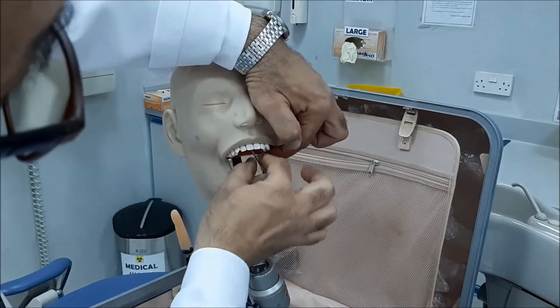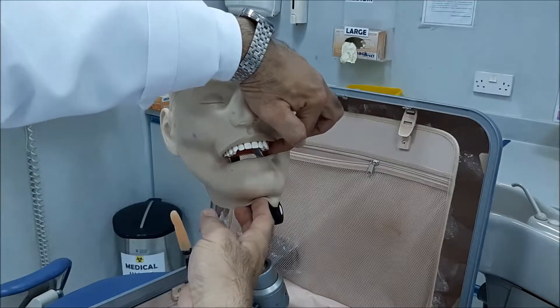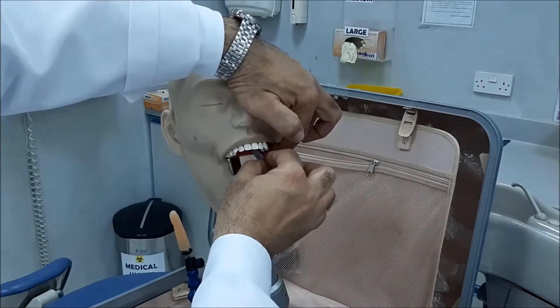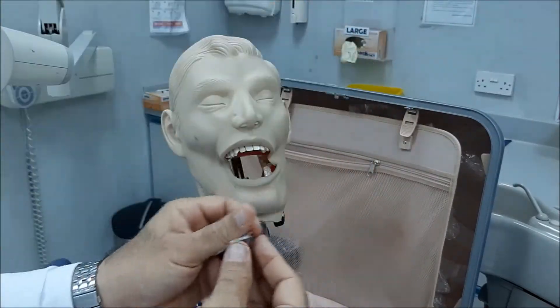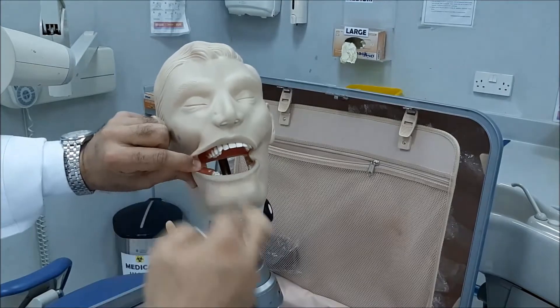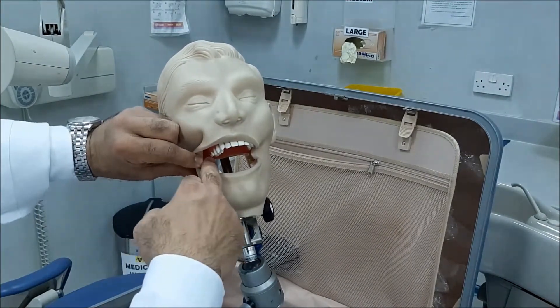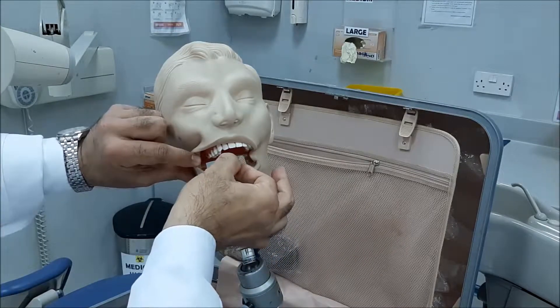If you place it too much this way, see what happens — it will either become detached from the film, or it will flip, or it will be pushed inwards. So I'll shift to this side. This is the second molar. I'll place it this way, backwards, trying to avoid anything.